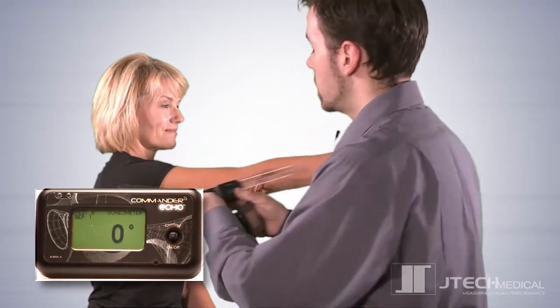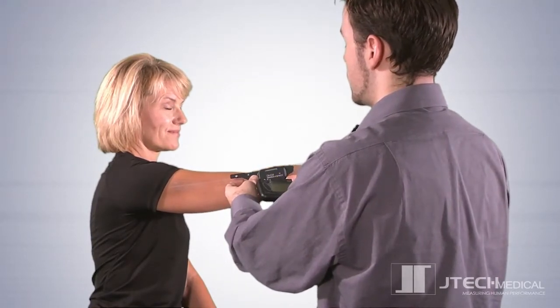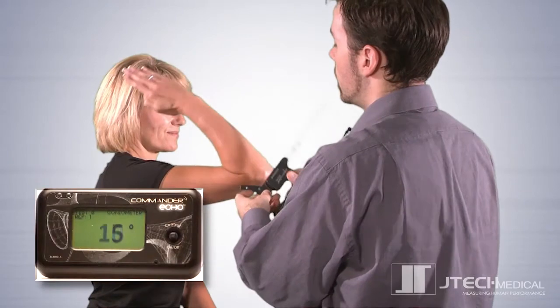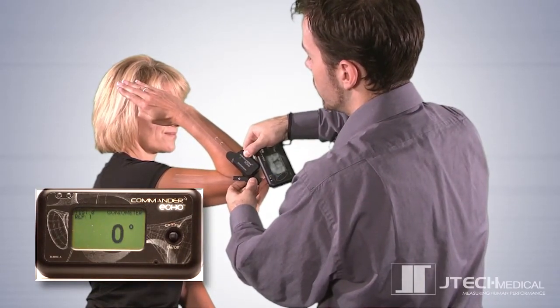You'll be asked to zero the device. In the case of the goniometer, align the goniometer arms in a position that is appropriate for the joint being measured and press the control stick to accept the value. Ask the patient to perform the motion in question, align the goniometer arms with the landmarks that are most appropriate, and press the enter button to accept the measurement.